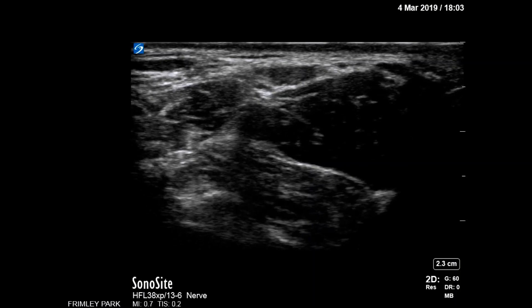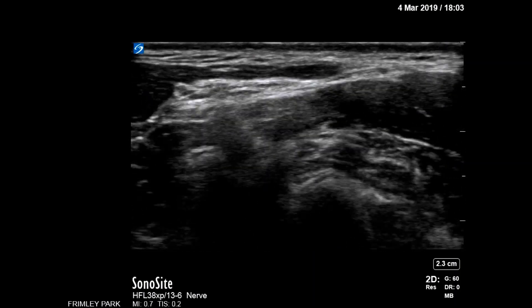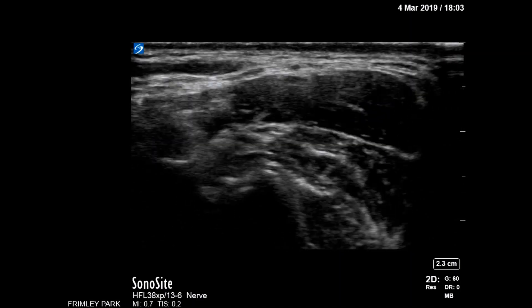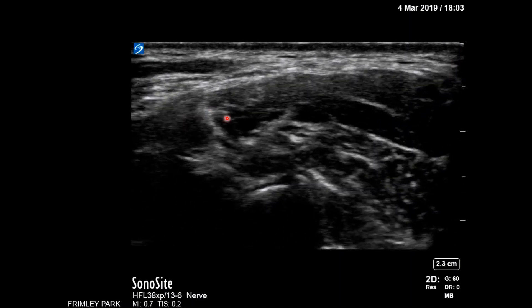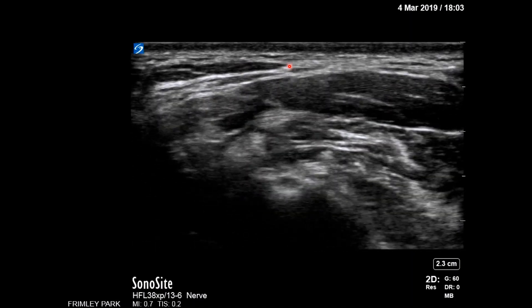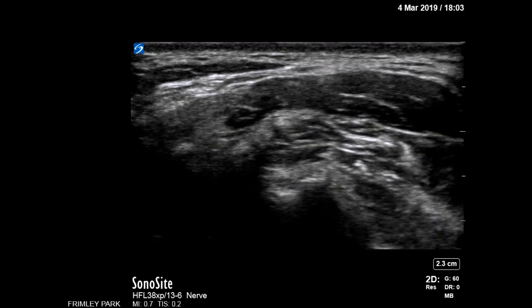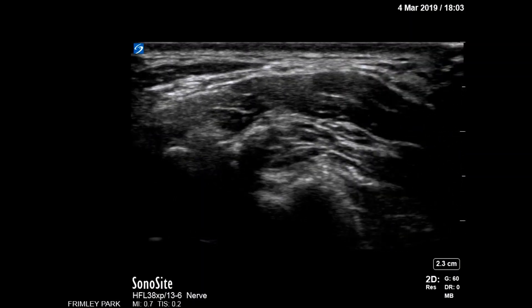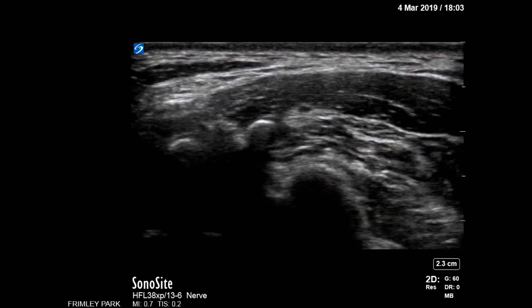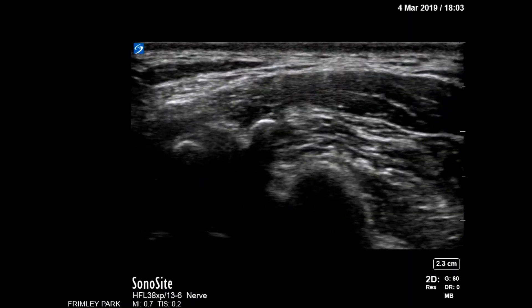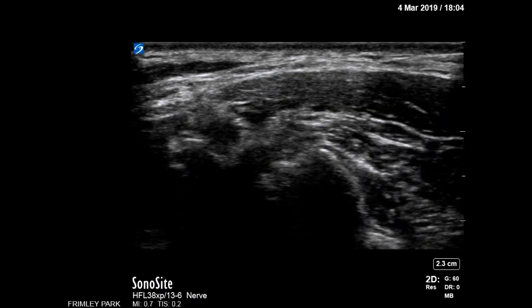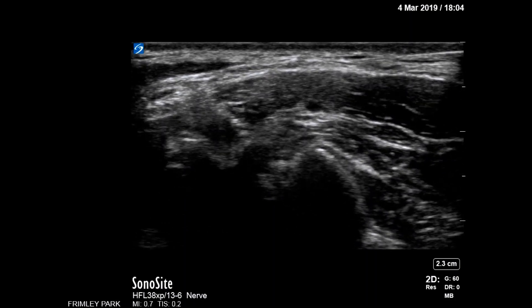This video demonstrates the performance of a supraclavicular nerve block. Scanning is done at the level of C4, where you can see the nerve roots of C4 entering the transverse process, the posterior border of the sternomastoid, and the supraclavicular nerves just behind it, resting on top of the scalenus medius muscle. The needle comes in-plane from a posterior to anterior direction to penetrate the superficial cervical fascia, followed by a typical injection of 3 to 5 mls of local anesthetic.